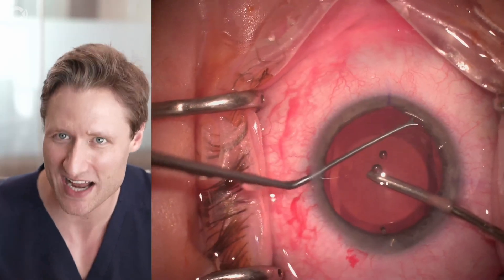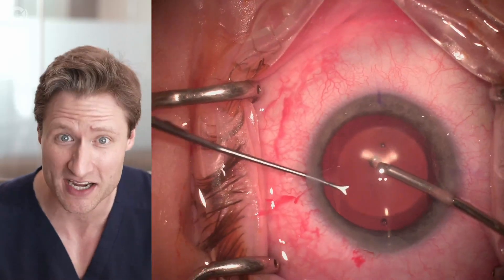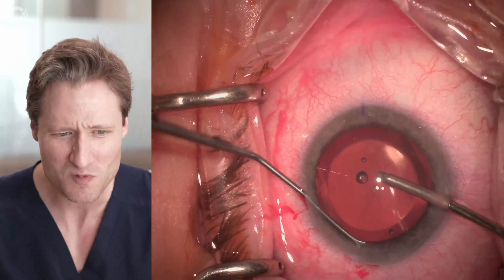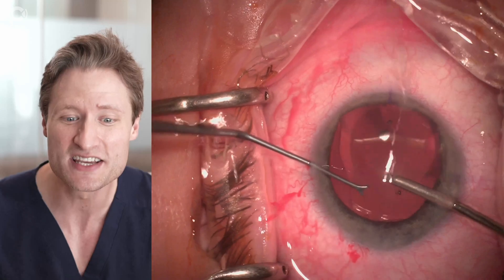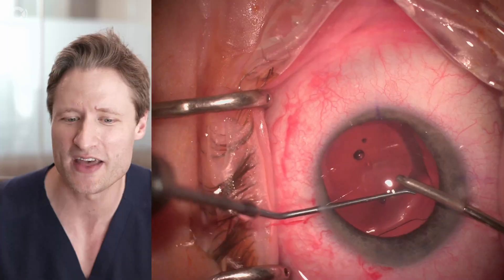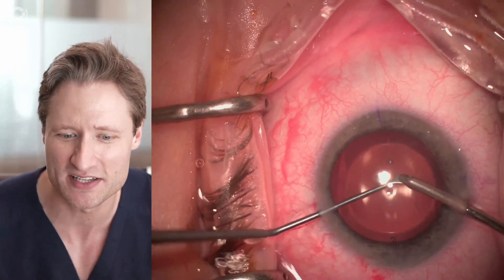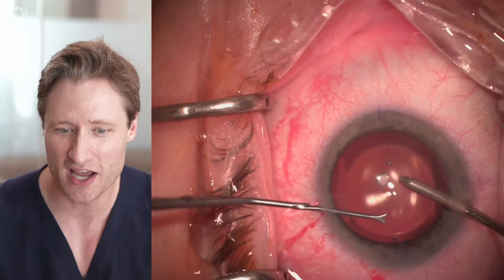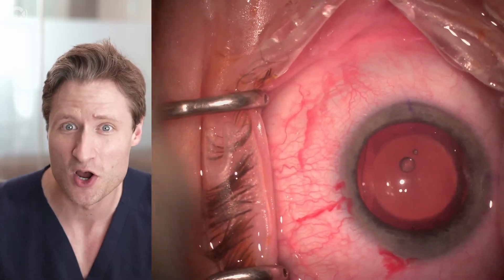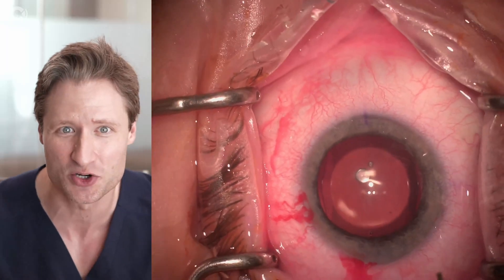I use a Y-rod, go into the space between the two folds, and push from the underside. This is a very reliable, easy way to flip the lens right side up. Having two paracenteses — one for the irrigating handpiece and one for this manipulator — is exactly why I always make them. I then use the manipulator to tuck the footplates on the haptic edges of the ICL and rotate the lens into position, all without gouging the anterior surface of the crystalline lens or the back surface of the cornea.